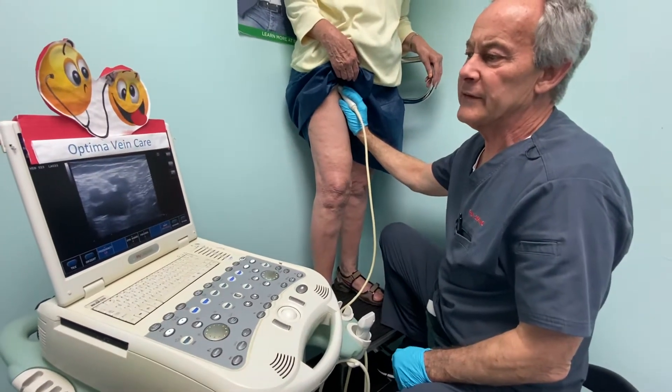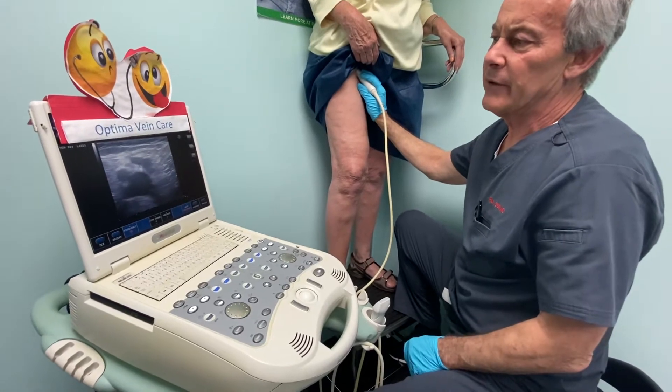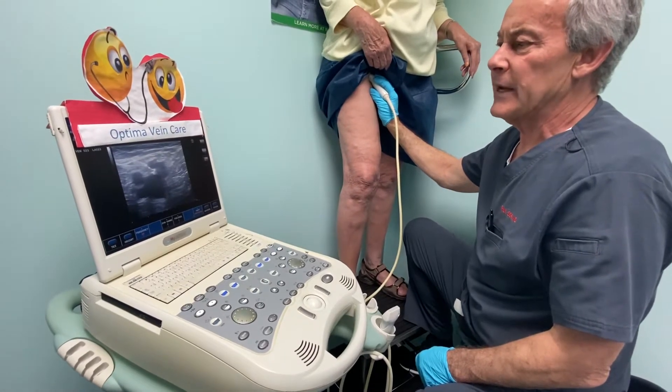Today we're doing a post venous seal follow-up. The patient had this last week and we treated a right anterior duplicate, which is the primary vein on the right leg of this patient.